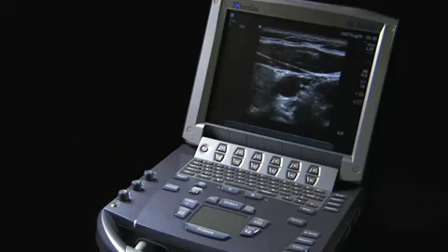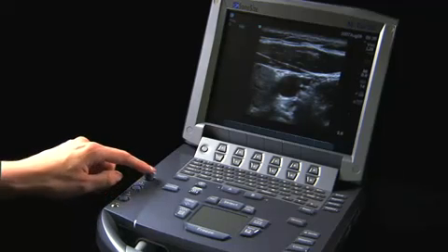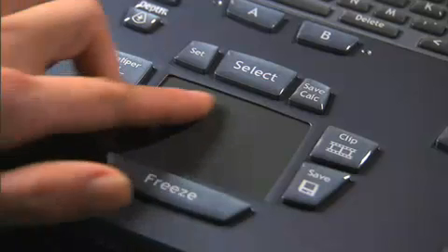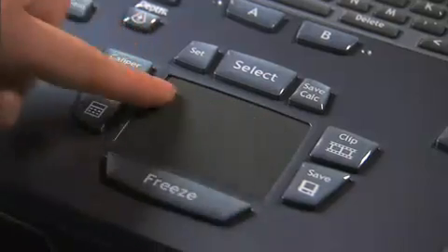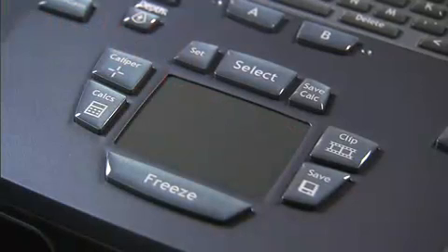When closing the system for transport, depress the knobs to lock them into place. In the lower middle of the control panel is the touchpad, which can be used to select, adjust, and move objects on the screen.